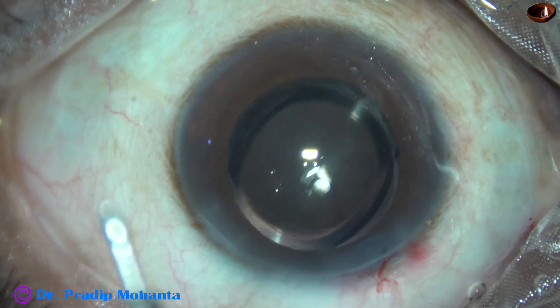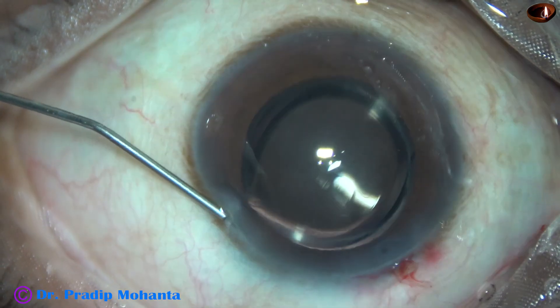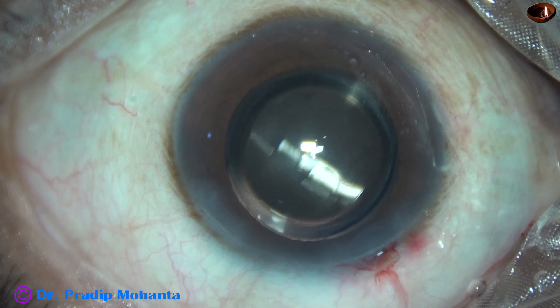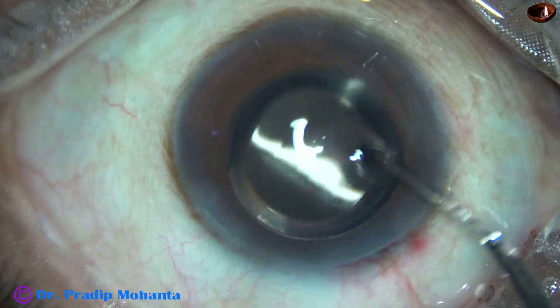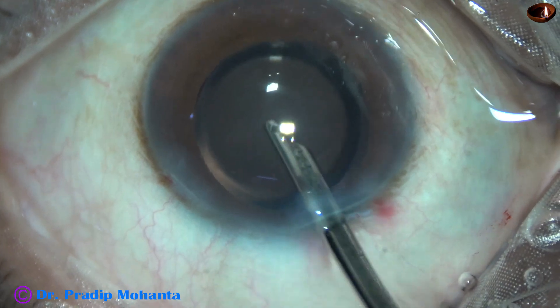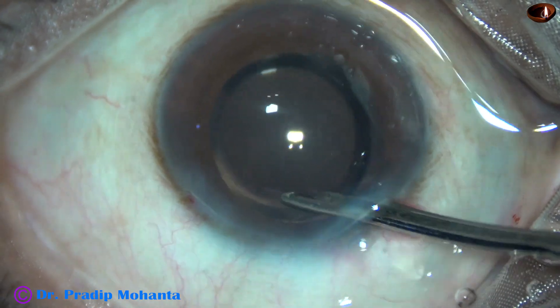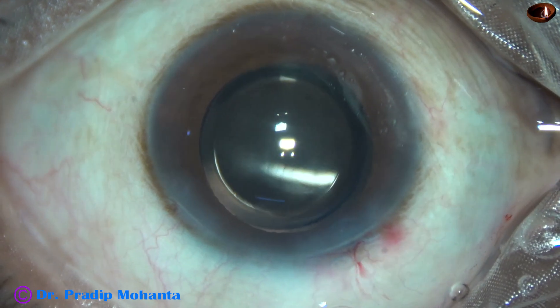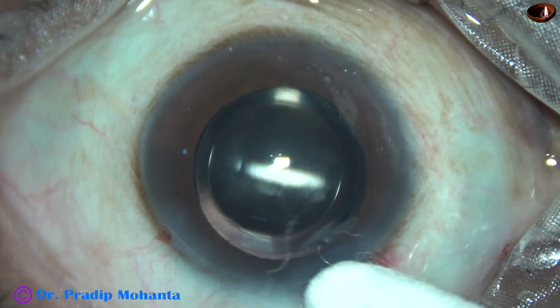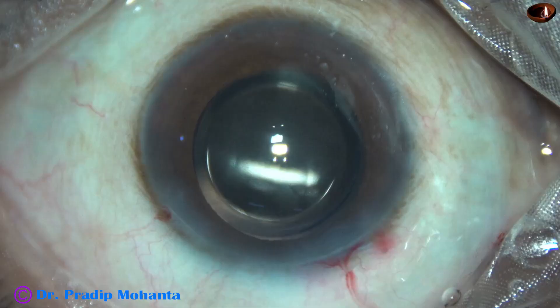This is a bit of Moxifloxacin. The side port has been closed by hydrating the corneal stroma. And finally, this is the anterior chamber lavage to remove any particulate matter and to form the anterior chamber with BSS. The anterior chamber is nicely formed. Integrity of the wounds is checked — there is no leakage from the wounds. A few drops of Moxifloxacin is applied over the ocular surface and the case is concluded.